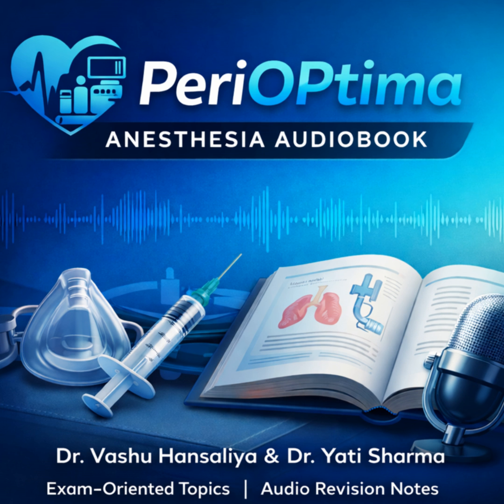Okay, so we have a helium balloon in the aorta. The core principle is counterpulsation. Talk to me about timing. You said it was sluggish if it wasn't helium. Timing is the most critical concept for the exam paper. You must get this right.